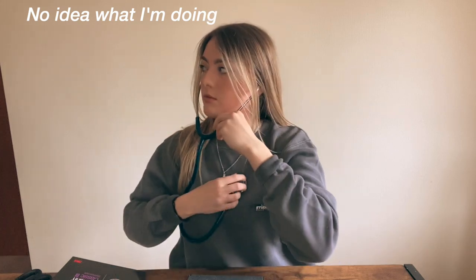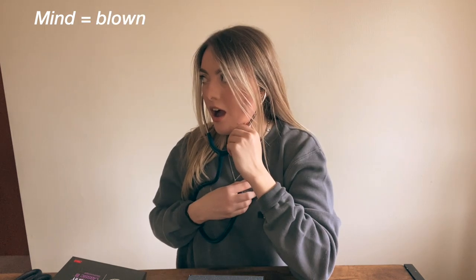There it is. Oh my god, my heart's beating really fast. I can hear it. Oh my god. So yeah, this is my stethoscope!